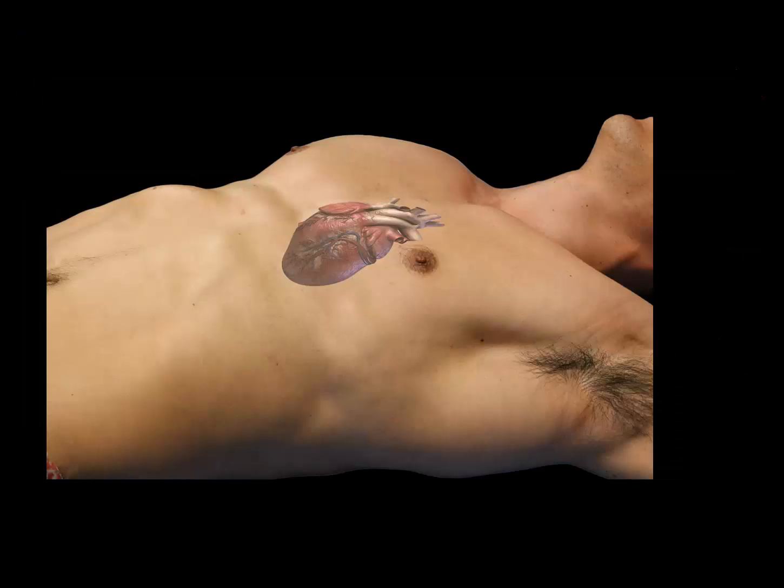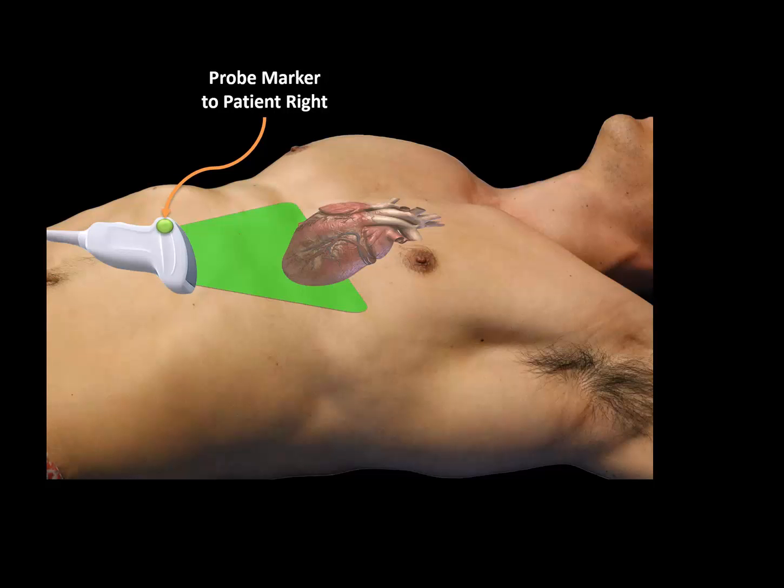Let's move on to the pertinent orientations for this study. All of our patients are in the supine position, as in this picture here. Our aim is to generate a coronal view of the heart using a subxiphoid view or approach. Let's show this orientation in a very simple cartoon diagram.